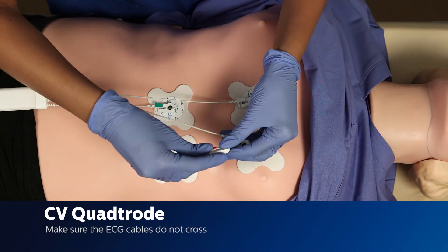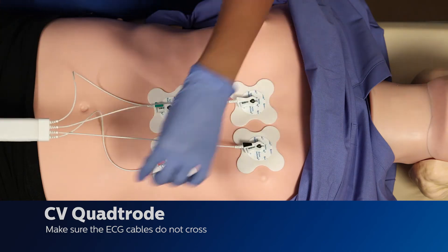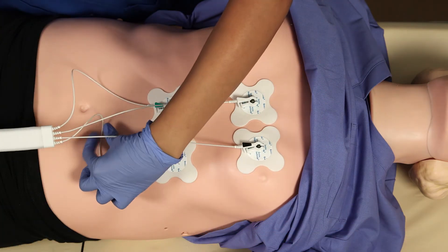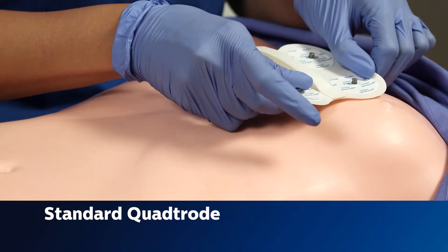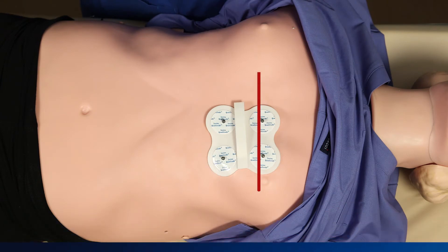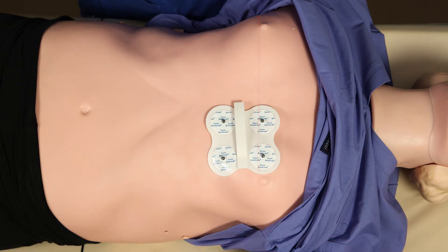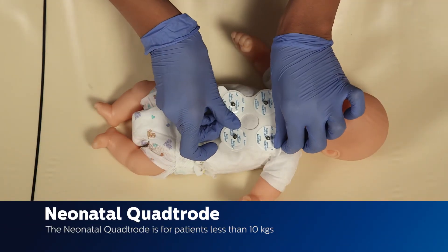After placing the quatrodes, make sure the ECG cables do not cross. When using the standard quatrodes, the top half will be in line with the imaginary nipple line, and the patch will be slightly to the left side, not in the center of the chest. When using the neonatal quatrodes, the patch will be placed in the center of the chest.